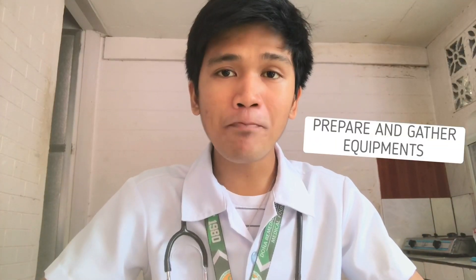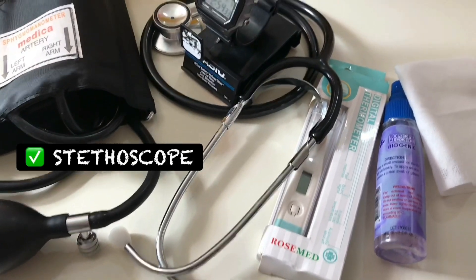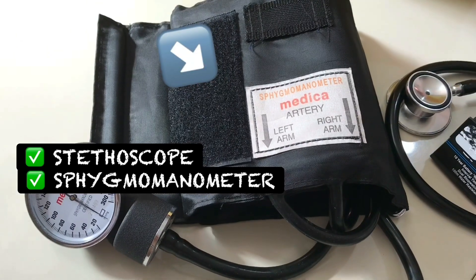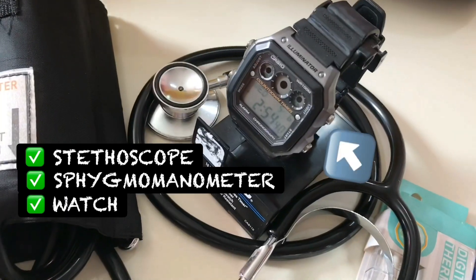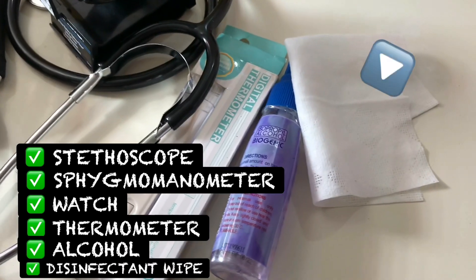Step number one: prepare and gather your equipment and supplies. You will need a stethoscope, a blood pressure cuff or sphygmomanometer, a watch, a digital thermometer, alcohol, and a disinfectant wipe.